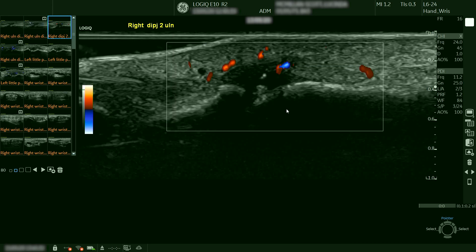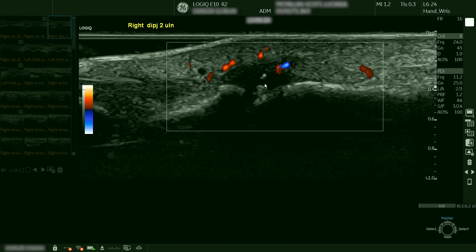Using the L624 probe we can see much more detail within the joint, and now it is obvious that there is an erosion within the middle phalanx head. There is also a small fleck of calcification that we saw previously which is or was attached to the erosive area.